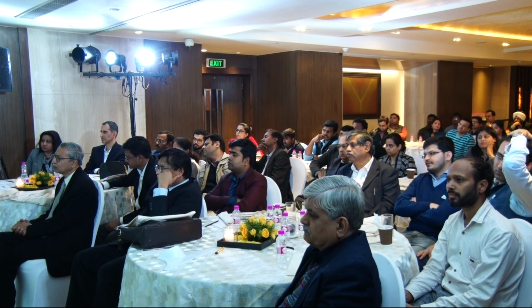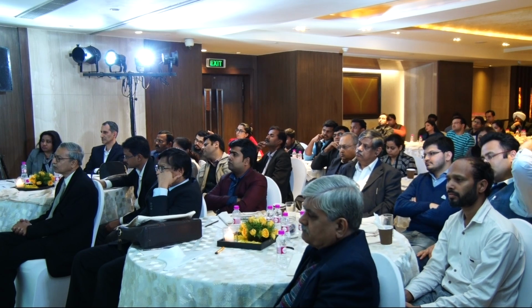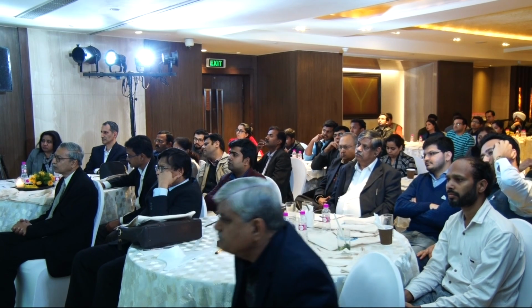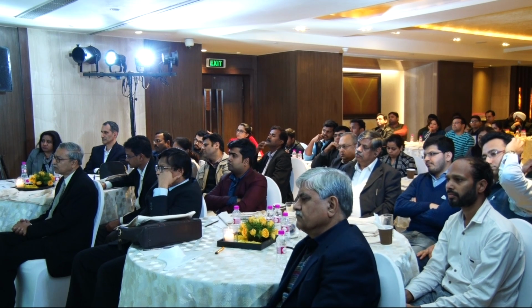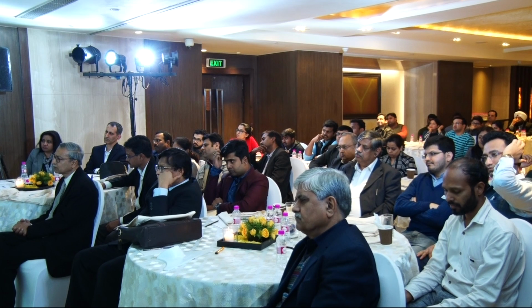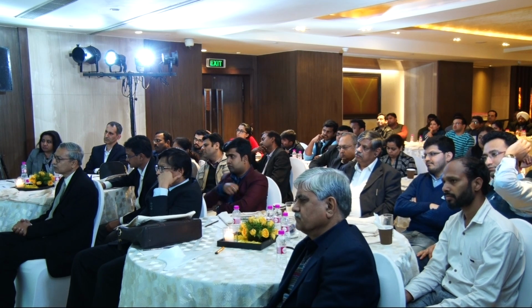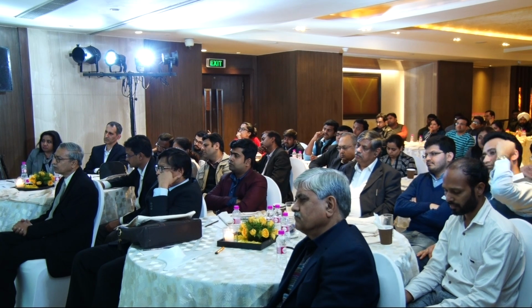The entire vertical axis on these graphs is the 1 millimeter SRS tolerance, and you can see on the patient-specific QA on the left there, the orange, that in the last two couch angles, you're getting close to the 1 millimeter tolerance. You're right around 0.7 of a millimeter. But we know that this phantom's not moving. This is something we're doing before the patient ever shows up. And so we can kind of predict what's going to happen with this patient.